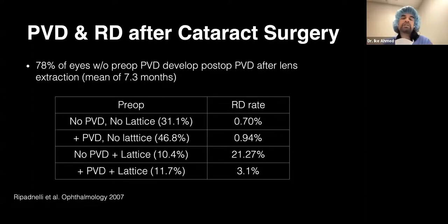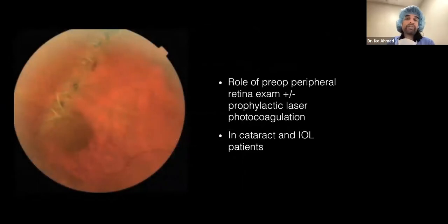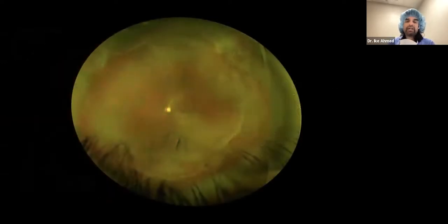But it's particularly important for detecting peripheral retinal pathology, looking for lattice degeneration. Because if I see this, I'm referring this patient to Dr. Mills to assess whether he would consider doing laser for this patient before I do cataract surgery. And for that matter, the same for me, at least, I consider for LASIK as well. In fact, for any intraocular procedure where we have any manipulation of intraocular pressure as well. And I think that's an important lesson in consideration for this.